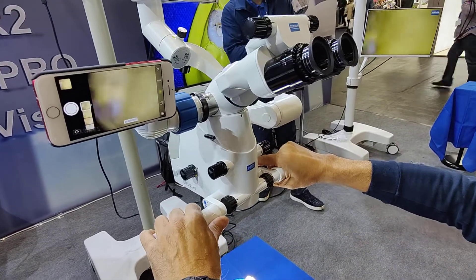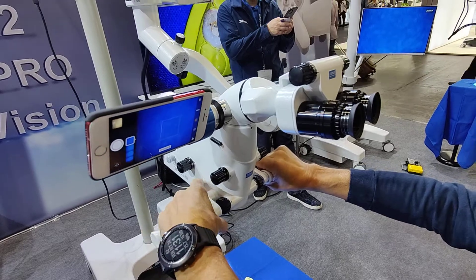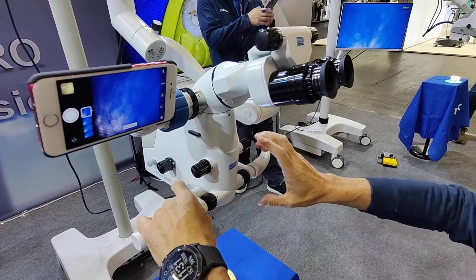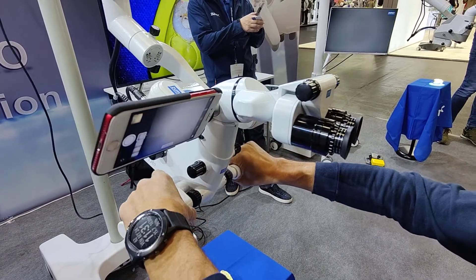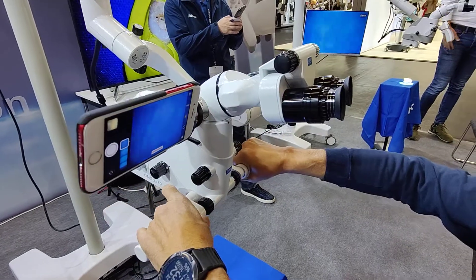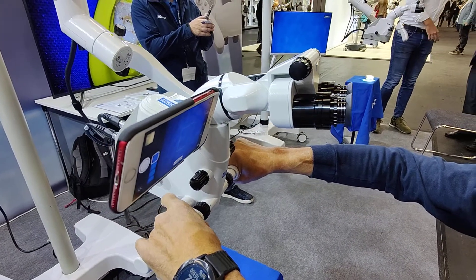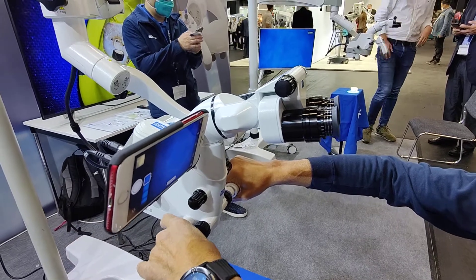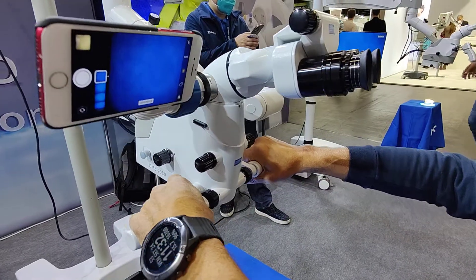Another very easy and comfortable feature is that we have an integrated video camera. In this version we have a 4K video camera and we can control it from these two push buttons on the back. Always with the finger, very easy to use. Push short and we have a photo, a picture, and if we push long we take a video.